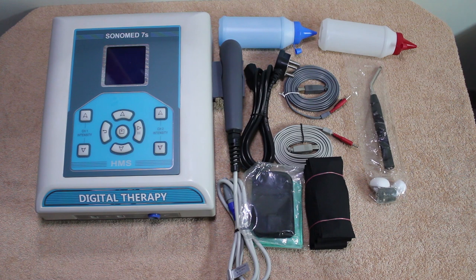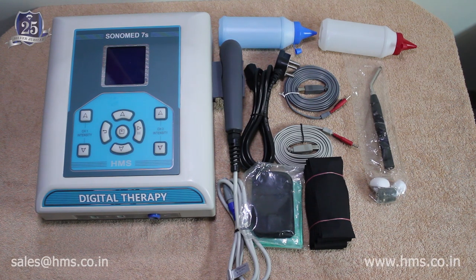This is our Sonomed 7s — the latest product from HMS and very advanced. It's a combination of all electrotherapy equipment and ultrasound. It has six different electrotherapy modalities and ultrasound all combined into a single package. This makes it a complete package for any therapy clinic or therapist who wants all sorts of electrotherapy equipment.